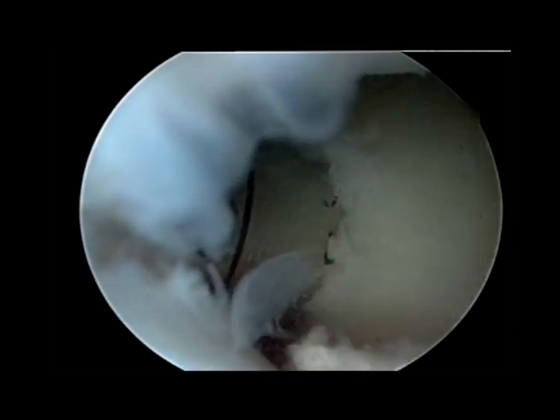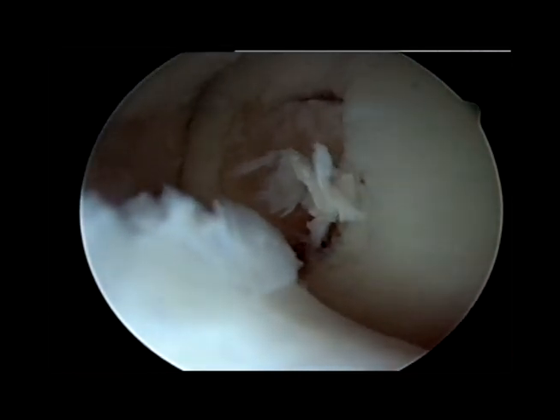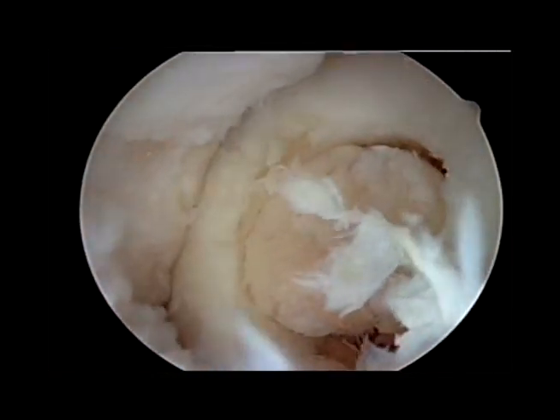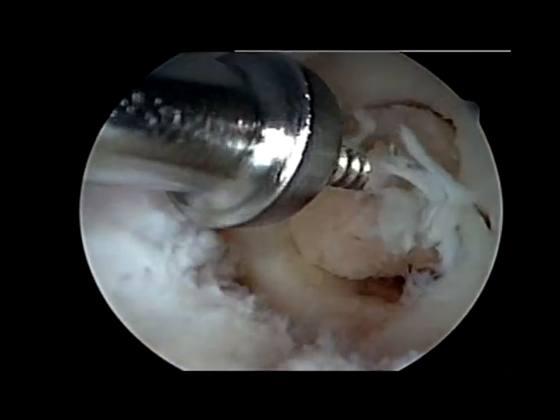We're going to take this plug out and then put the previous cartilage bone plug into the defect. Here things are lined up fairly well. We're going to remove that and then push in the area with the new cartilage. Here we can still see some of the bone in there that we're going to remove before putting in the new cartilage.